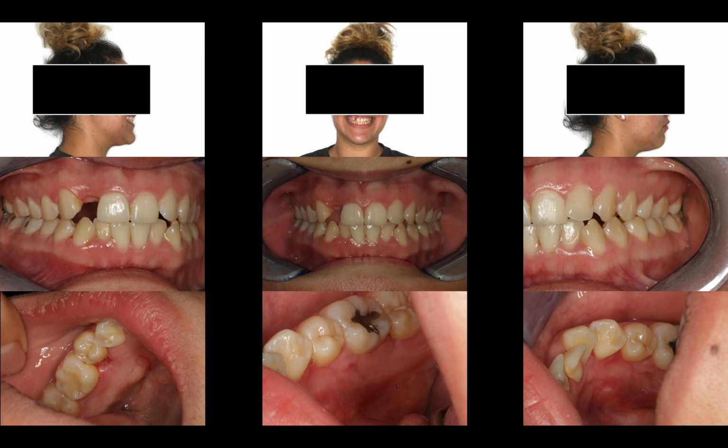Here, this is a couple of days or about a week or so post-operative where we did attempt the oral surgery graduate clinic to remove both supernumeraries number 70 and number 78. You'll see that they were successful in taking out number 70, but 78, while the crown of 78 was exposed, the oral surgery resident and attending oral surgery faculty recommended that we actually get CBCT imaging, which we did not have at that point, before we ended up extracting that tooth, which ultimately came to our benefit and the patient's benefit. So you'll see that we took that later.